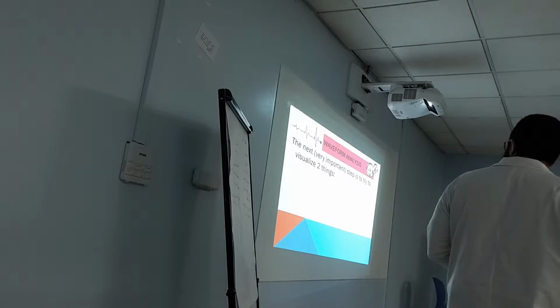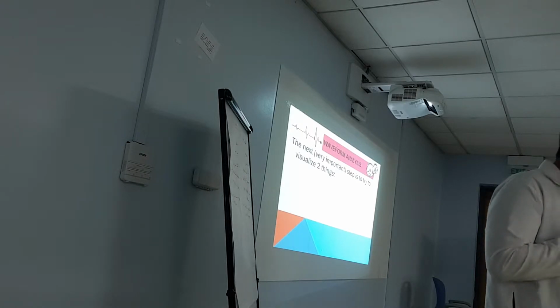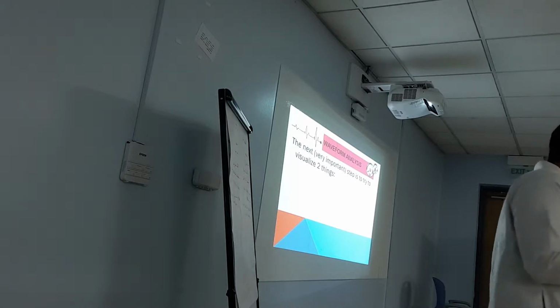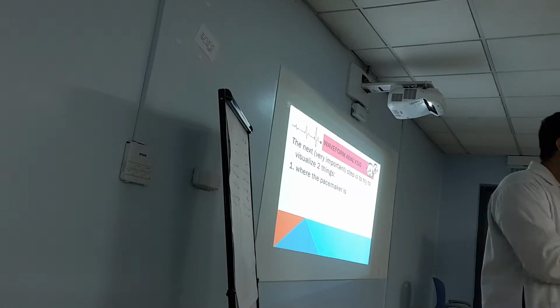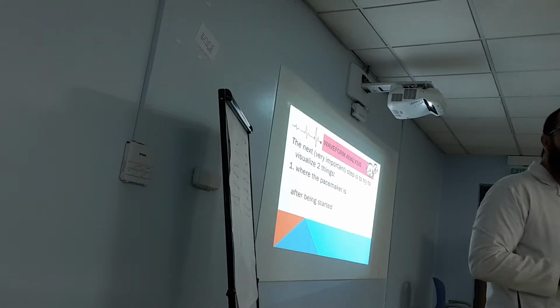First, what we need to learn from the ECG. First of all, if the patient, alhamdulillah, has a heart rate, is not in arrest, this heart rate is produced by which control? Okay, this is the pacemaker. Then the next thing, how this electricity will spread in the heart? Is it spread normally, or there is some blockage in the way, some delay, some disease that makes the electricity go slower? Okay.